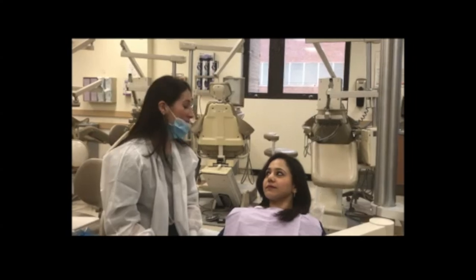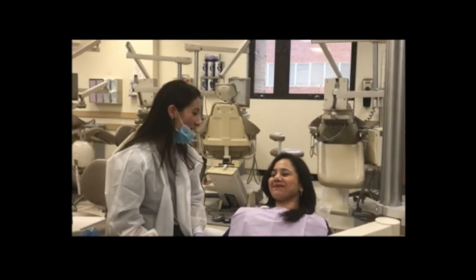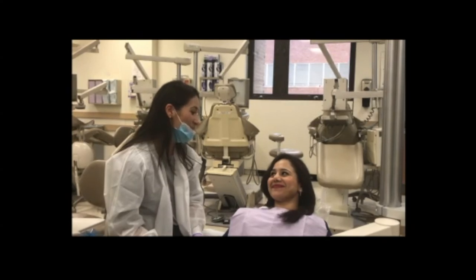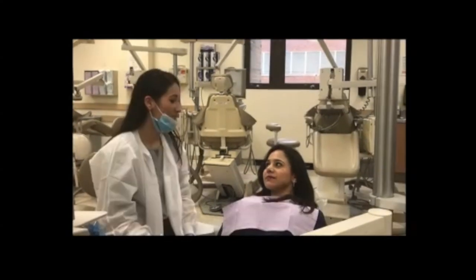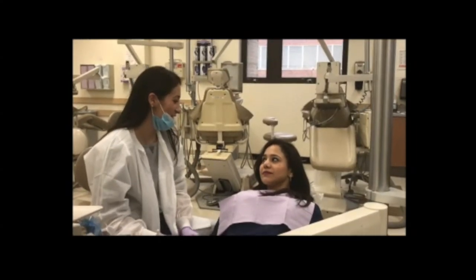Hi, I'm Dr. Rifka. We're going to be... Hi, I'm Dr. Rifka and we're going to be cleaning your teeth. We're going to be making sure that they're extra squeaky clean and super... Damn, I can't talk to them. Hi, I'm Dr. Rifka. We're going to be cleaning your teeth today so they can be extra shiny and squeaky clean.